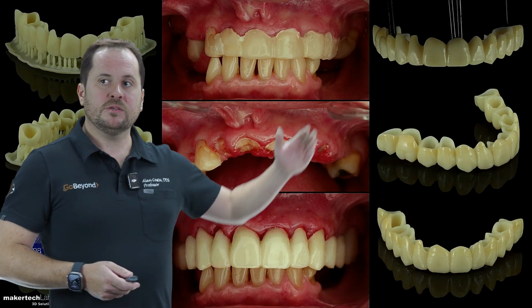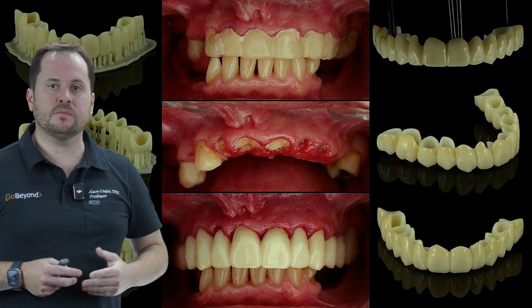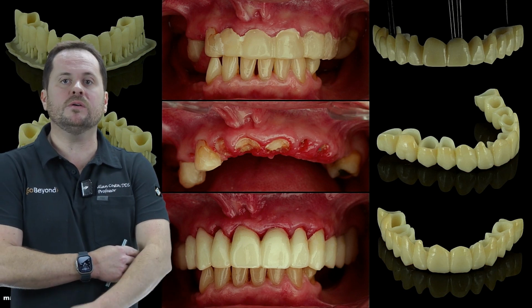So for instance, the patient presented in this way, and indeed, we needed to make an adjustment for this patient.